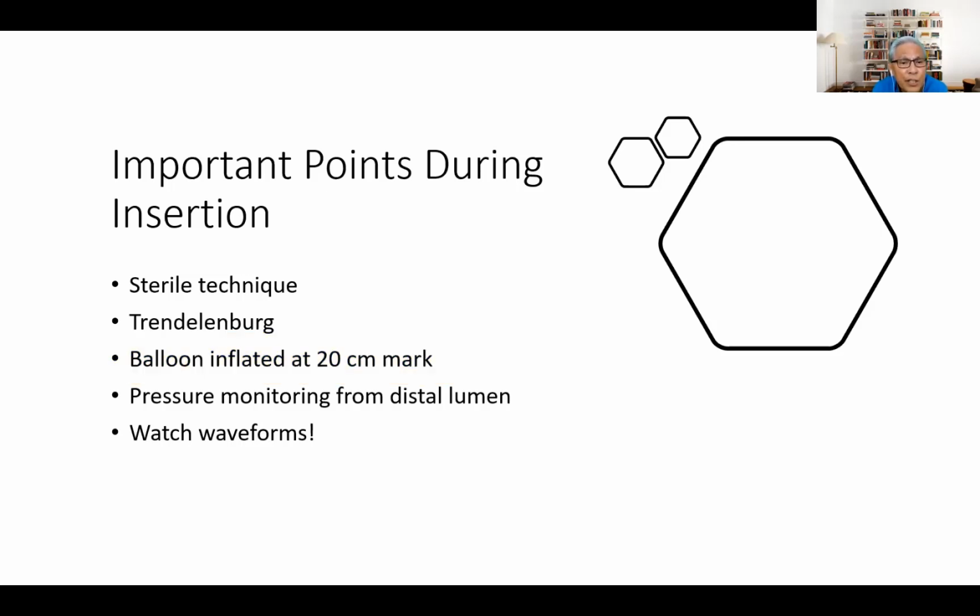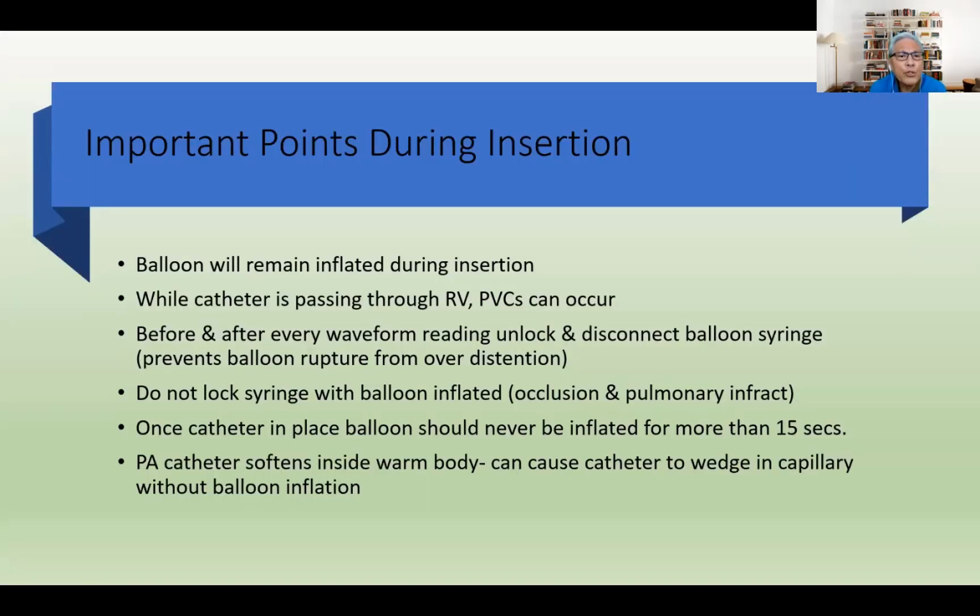The one that's inserting it, either the cardiologist or perhaps the anesthesiologist, will ask you to inflate the balloon. The balloon is inflated, and therefore it's going to now move forward along with the flow of blood. And of course, we're going to make sure that we are going to monitor the pressures as the catheter is being advanced. We need to know the waveforms. Very important points during insertion.